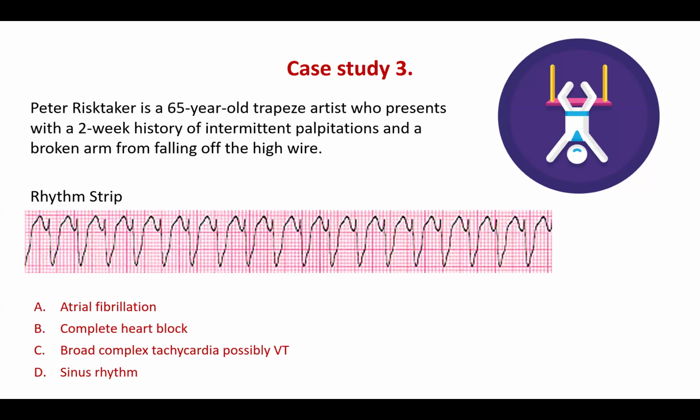We've got another question here, Glenn, around some troubleshooting tips. If you're having problems getting a clean ECG reading, quite often they're getting some sort of artifact or AC noise. They've tried replacing dots, asked patients to remove any electrical devices and jewelry. Do you have any tips if we can't get a clean ECG reading?